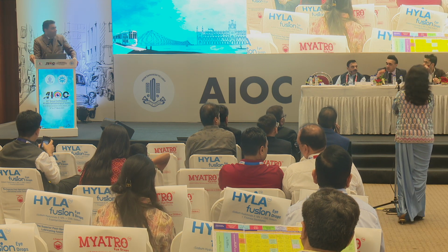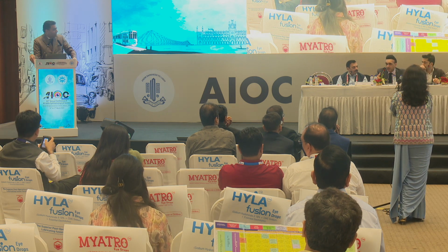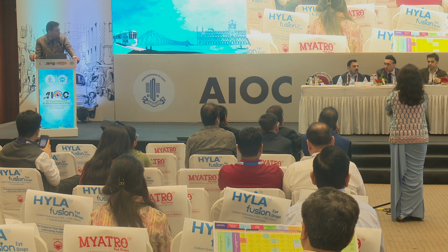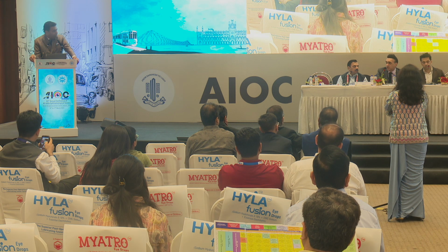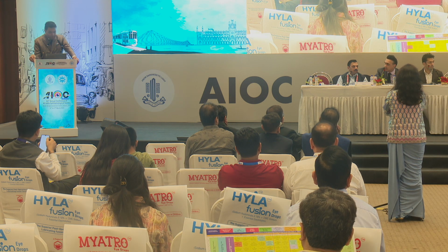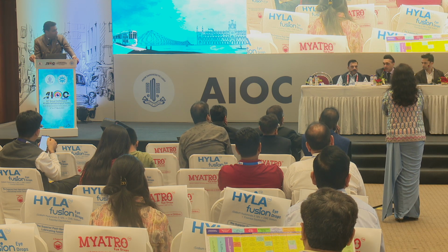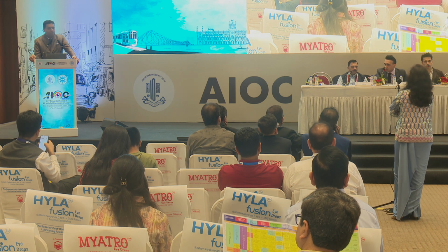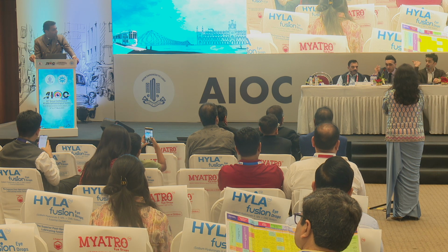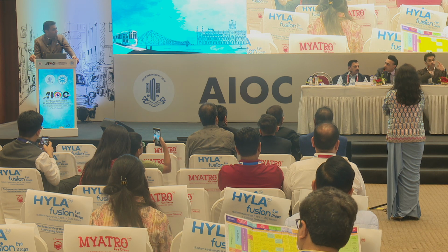Rohit, just to add to that point, I have to say that your question is right, because at the end of the day, the gold standard would be an RCT comparing Contura to a lenticule procedure. Even though I do a lot of lenticule extraction, it's not that I don't do any LASIK at all, and in fact all the LASIK I do is Contura based or topography guided.